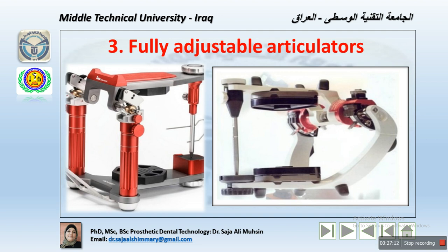with fewer errors coming from improper handling or working in terms of using these instruments. One of the disadvantages of this fully adjustable articulator is that its use demands a high degree of skill on the part of the clinical and technical personnel. Otherwise, whatever readings the clinician takes, the technician cannot handle, and vice versa. That means if the clinician or practitioner does not really know how to use it, then the technician cannot deal with it properly.